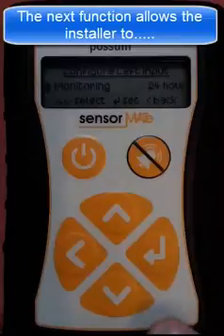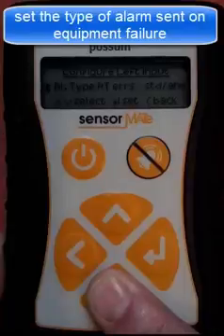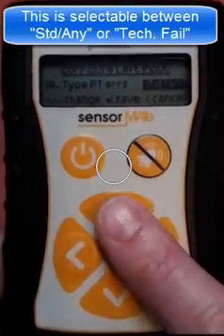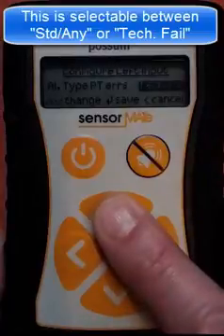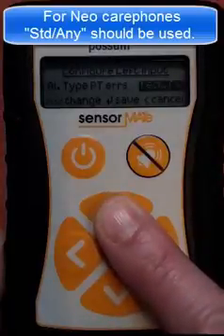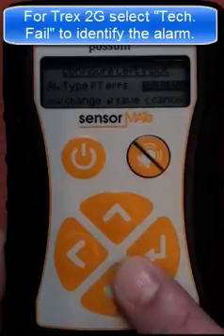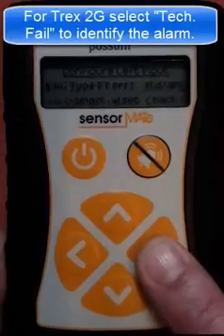The next function allows the installer to set the type of alarm which is transmitted during equipment failure. This is selectable between standard, any, or technical fail. For Neo carephones, standard any should be used. For Trex 2G installs, select technical fail to identify the alarm.